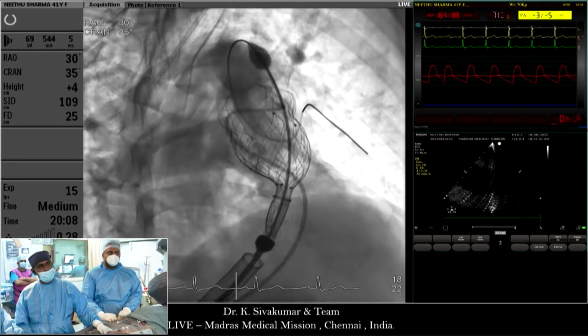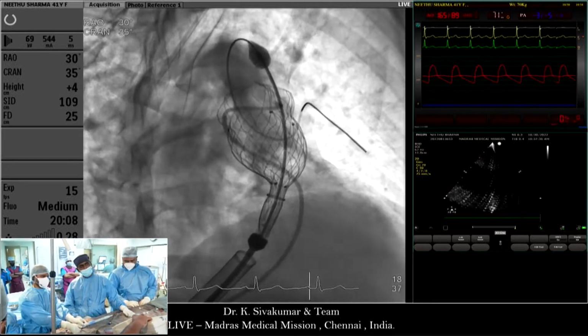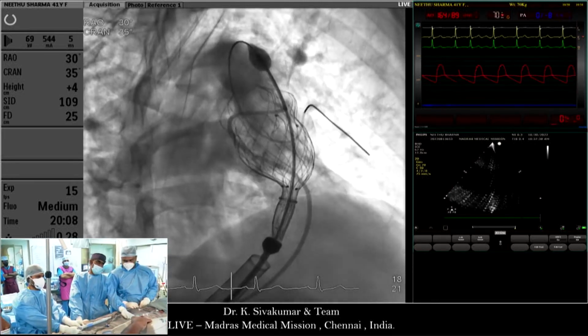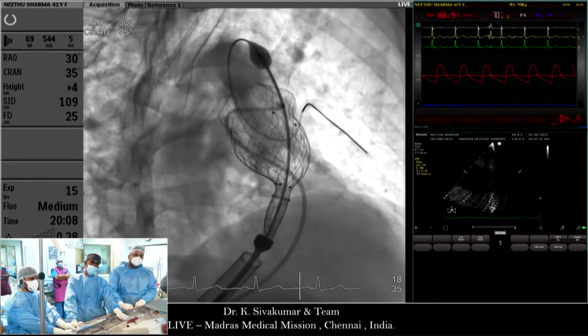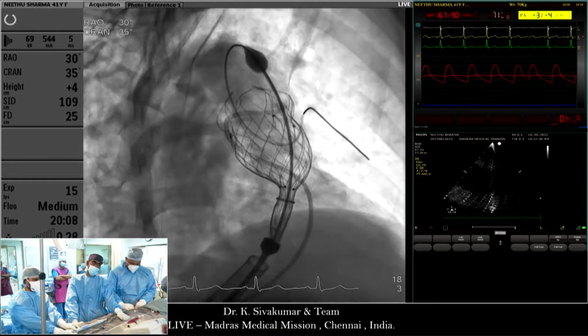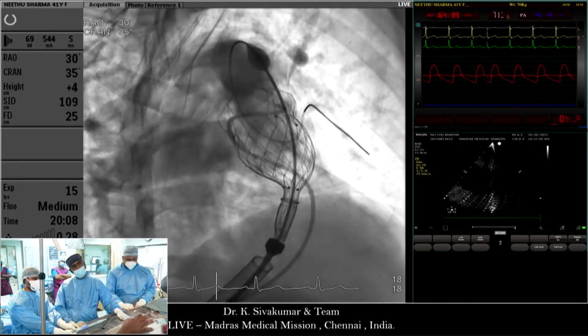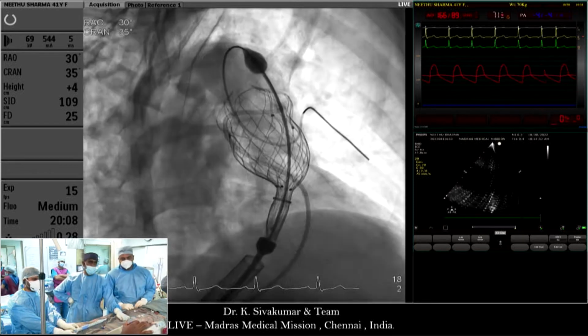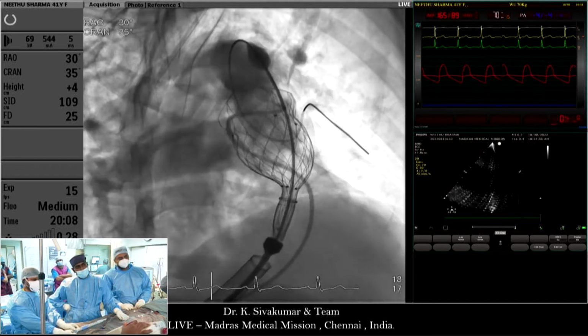Yeah. I think it is oversized there. What do you think, Varakan? Oversized by what? Ahmed, is it the length? I don't think it's oversized, but actually the valve is not aligned with the RVOT right now. Let me ask you a question. Sisi, do you think that once I release the distal flare, it will fling back and then it will get opposed?